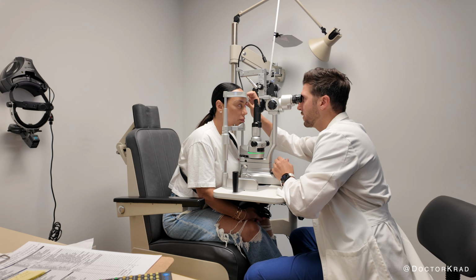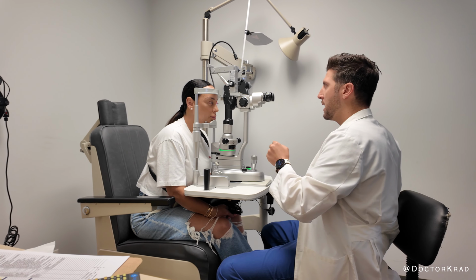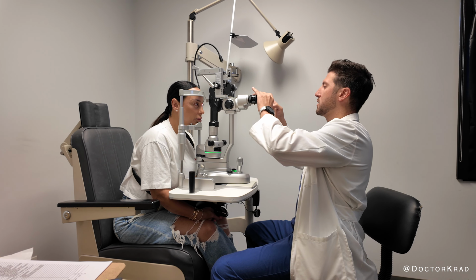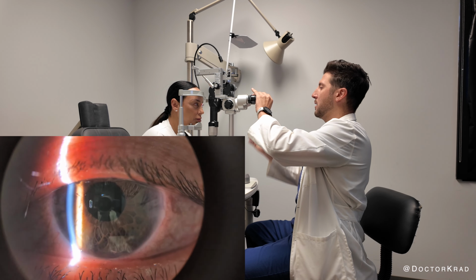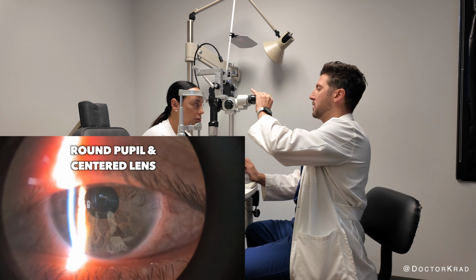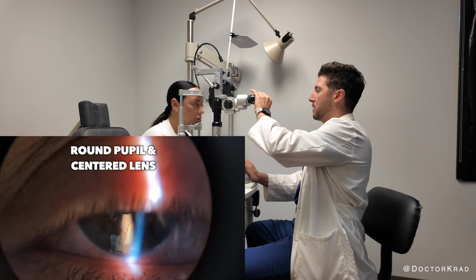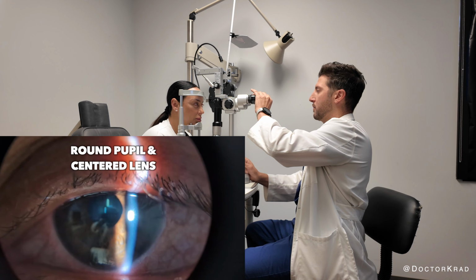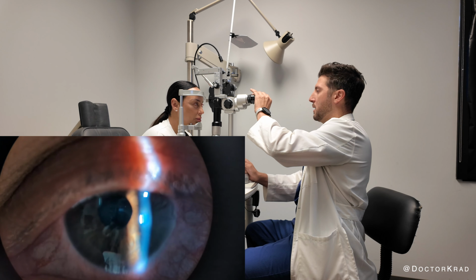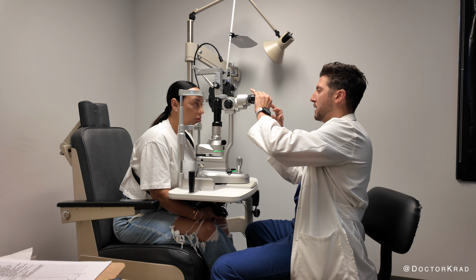It looks great. So far, the lens looks really, really good. I'm going to show it here on this. And you can just keep looking straight ahead towards me. All right, because we're just one day out right now, but it looks nicely centered. I'm going to turn it this way. Good. Very good. Blink. All right. Open as wide as you can. Perfect. Just like that is great.